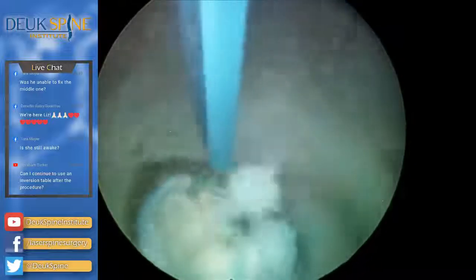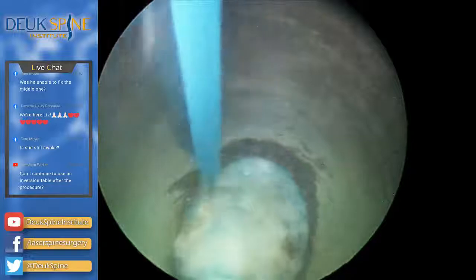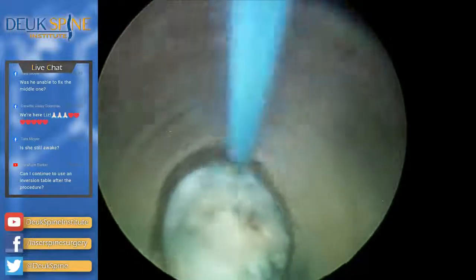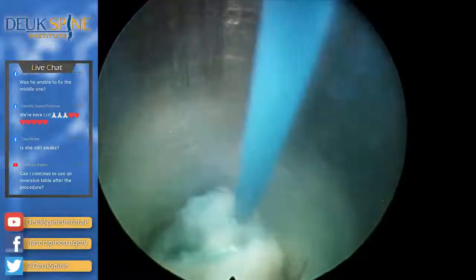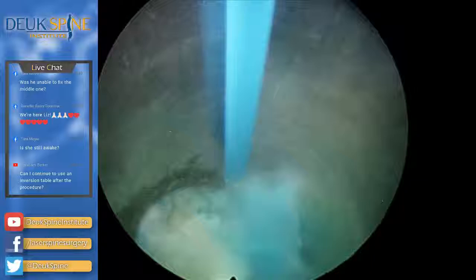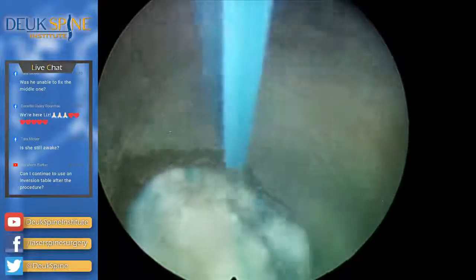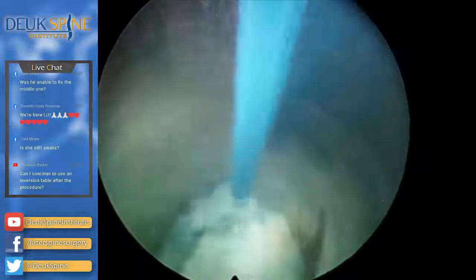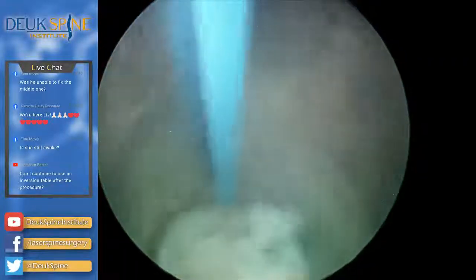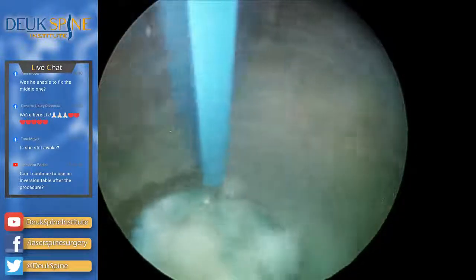Whereas the more superficial part appears to be collagenized, so it looks like she may have injured this initially a long time ago, healed this disc, and then more recently re-injured it again. You can see the bits and pieces of the nucleus just falling off, and it's all staining blue, indicating that it's degenerated. Normal discs don't degenerate. A normal disc doesn't stain blue.